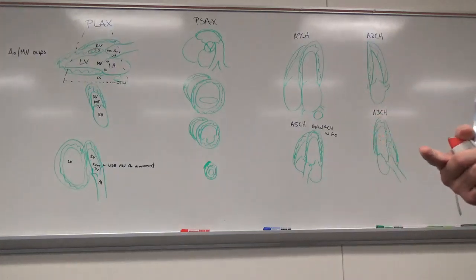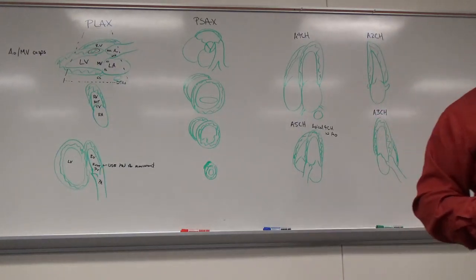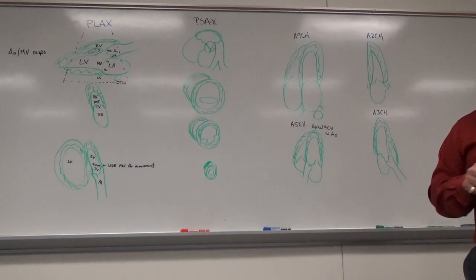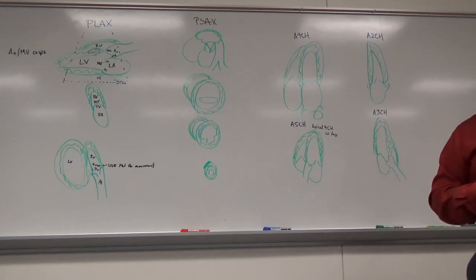This is where your time factor is going to decrease significantly, if you can control the breathing and you know how to do it accurately. For me, that came when my 2D echo got much better when I started doing stress echo, because I had to get them to do it really quick.